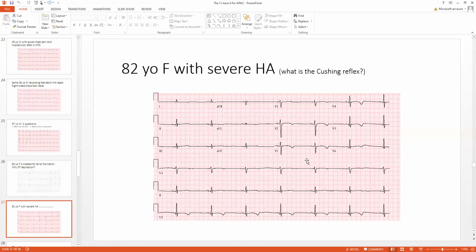Well, look at the location of this patient and look at the symptoms before you read the EKG. Make sure that if the patient's in the neurosurgical intensive care unit or has a headache and no chest pain, that these ST elevation T inversion changes shouldn't be read as ischemia, but you should say, does this patient have intracranial disease? If you were to decrease the intracranial pressure, you'd increase the rate, drop the systolic pressure, and gradually the electrocardiogram will normalize.